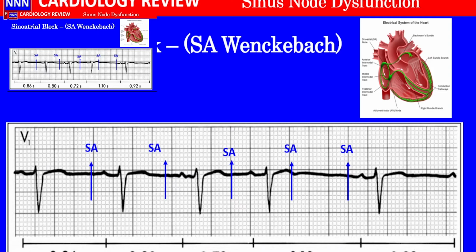That is, you have the atrial impulse coming here, and the AV node is kind of diseased, so that there is prolongation of the PR interval with successive beats leading to shortening of the RR intervals.